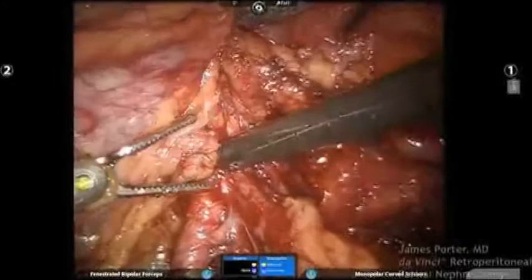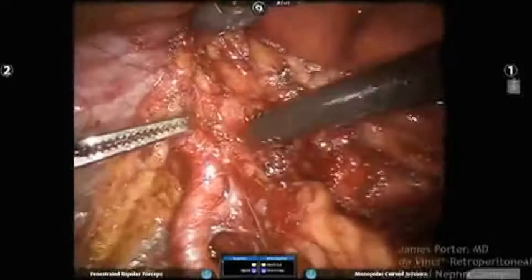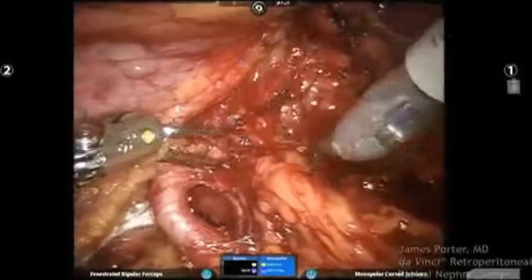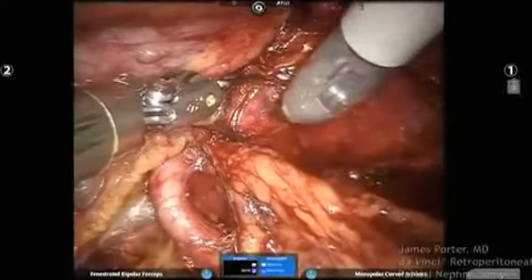I would make one caveat, which is exactly what you said, when you're starting out, the outcomes on renal function, as long as clamp times are below 30 minutes, are equivocal. I don't think anyone's really proven that leaving the vein unclamped makes any difference, and frankly, times have been debated. The importance when you're first starting out with this operation is to have a bloodless field so you adequately resect the lesion. It's bleeding that can be a real struggle for people. So as you said, you have to really consider, especially if you're starting out, whether you're really going to benefit from a bloodless field.